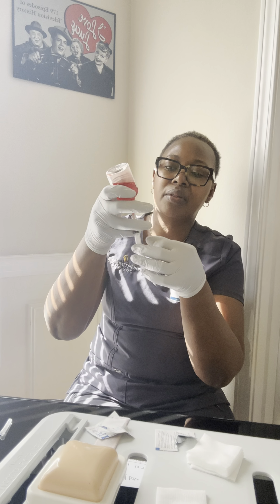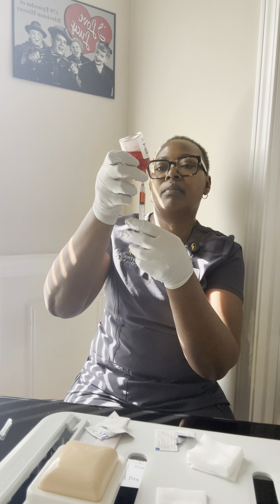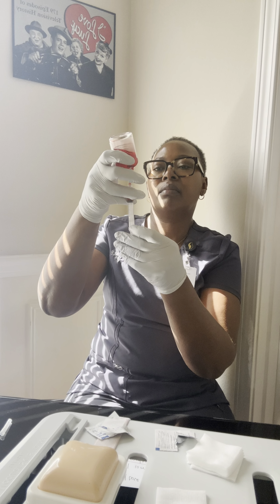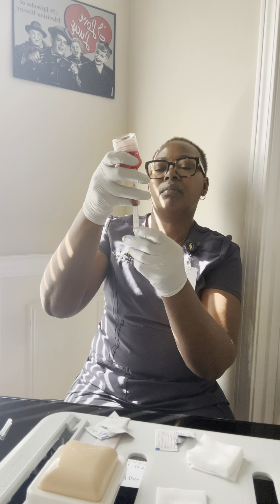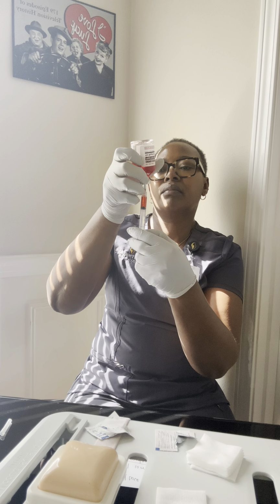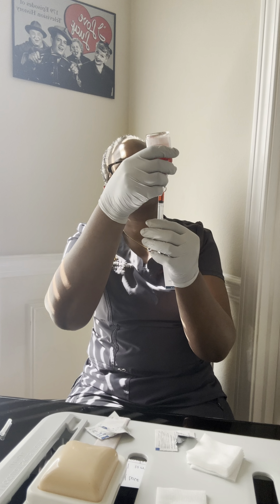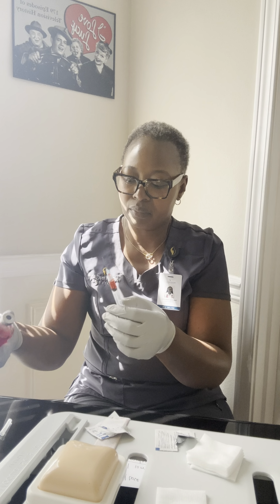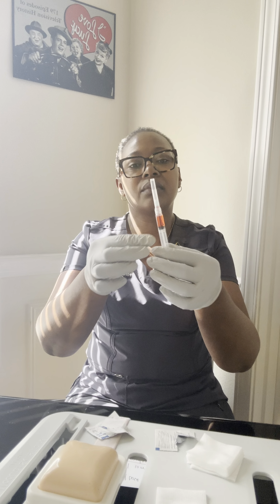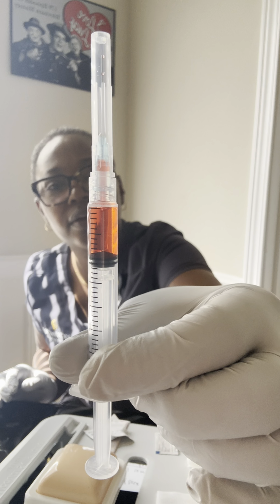I'll make sure there are no bubbles. 1 ml with no bubbles at all.